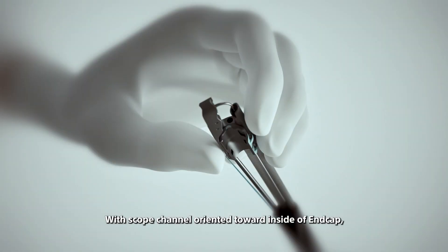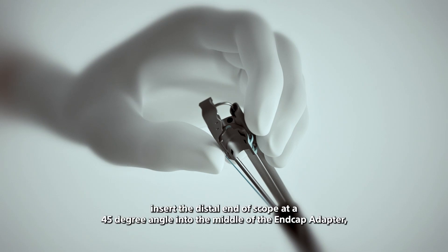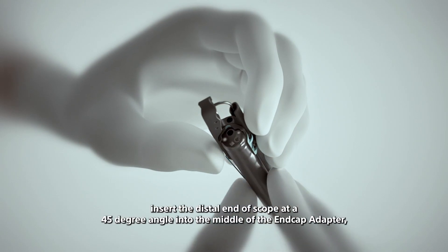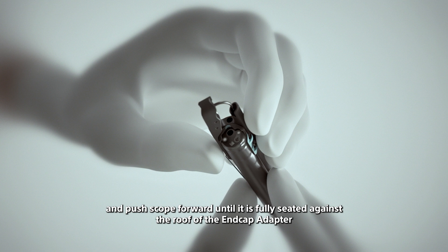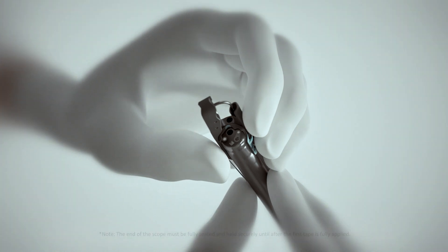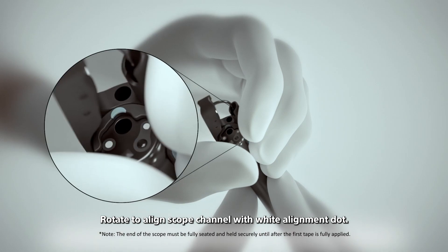With scope channel oriented toward inside of end cap, insert the distal end of scope at a 45 degree angle into the middle of the end cap adapter and push scope forward until it is fully seated against the roof of the end cap adapter. Rotate to align scope channel with wide alignment dot.